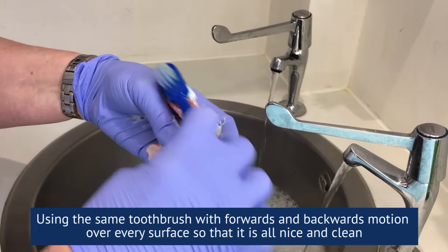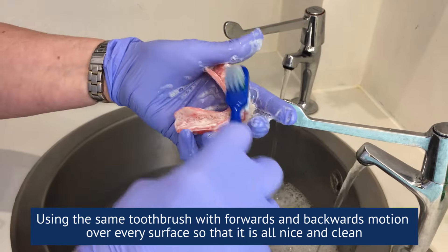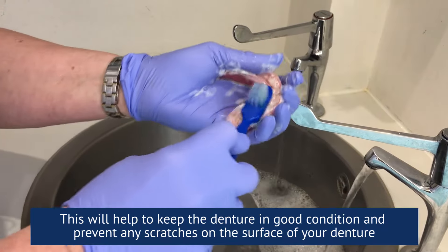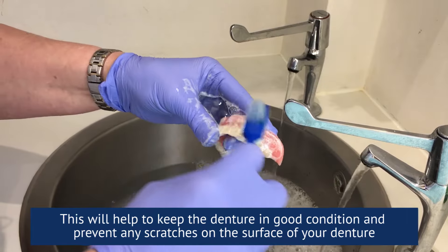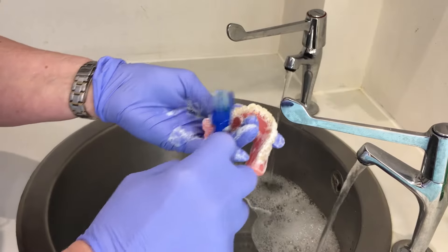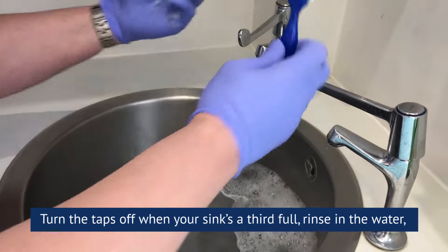Use a forwards and backwards motion over every surface so that it's all nice and clean. This will help keep your denture in good condition and prevent any scratches on the surface of your denture.